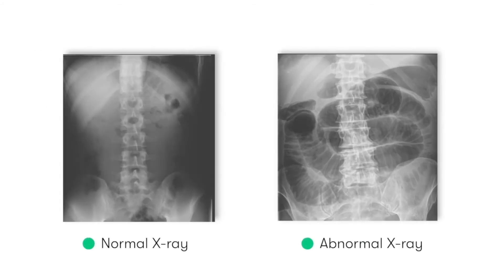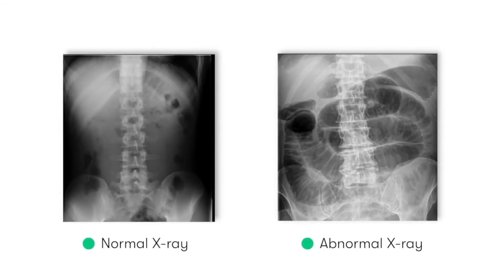Here you can see a normal x-ray on the left hand side and an abnormal x-ray showing small bowel dilatation on the right hand side, and we should be able to instantly appreciate that there's a significant difference between the two images.